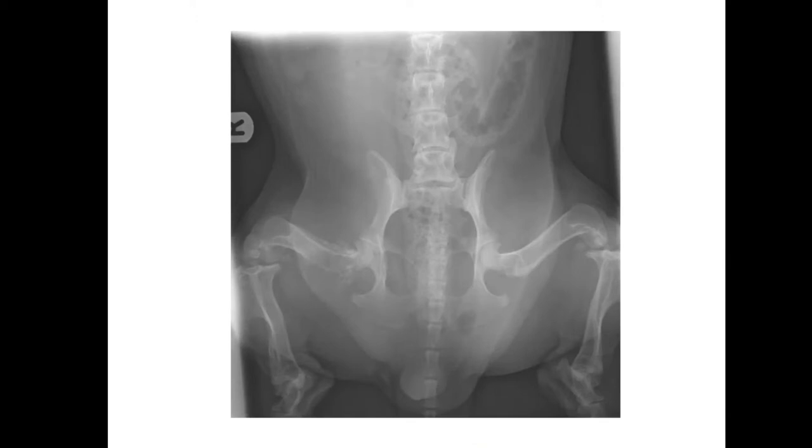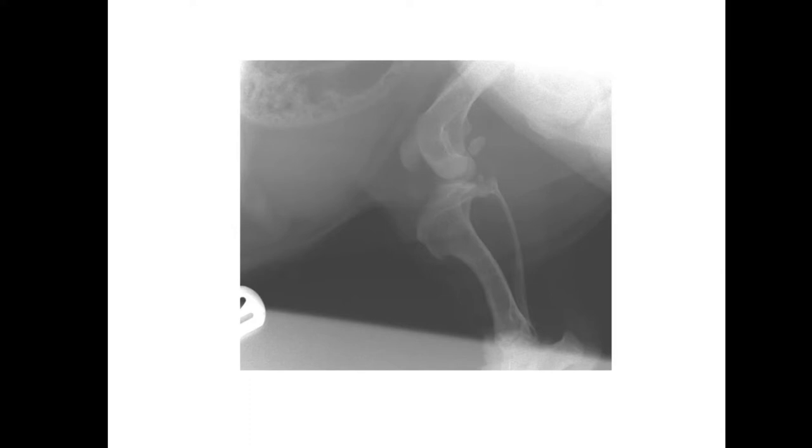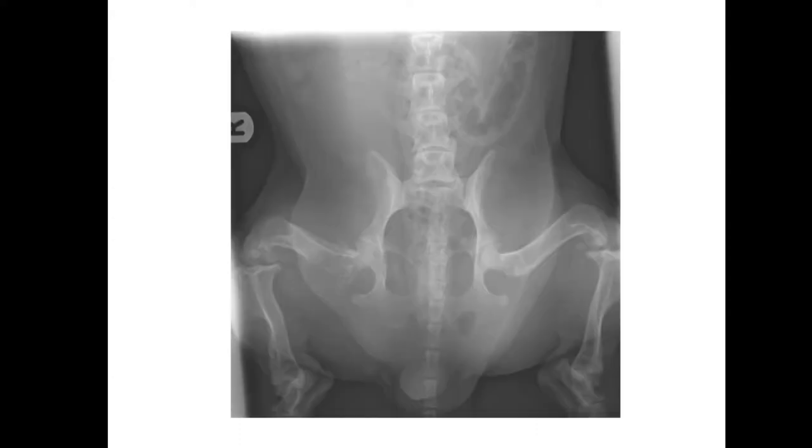We have two views of this animal. First, a mediolateral view of the right stifle, in which I cannot see much regarding problems, to be honest. I would say there is probably a little bit of osteoarthritis in the stifle joint and maybe a little bit of joint effusion. The quality is a little bit poor to see tiny details, but I would say the fat pad is a little bit retracted. But that was not my main finding.